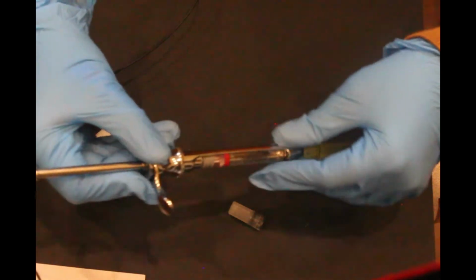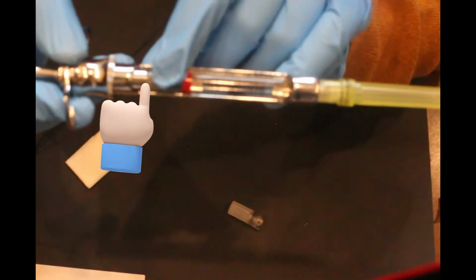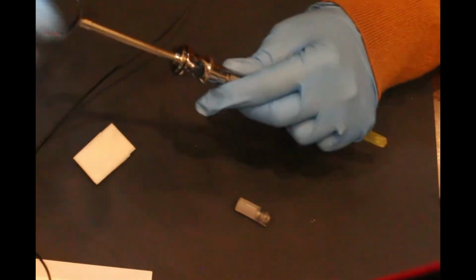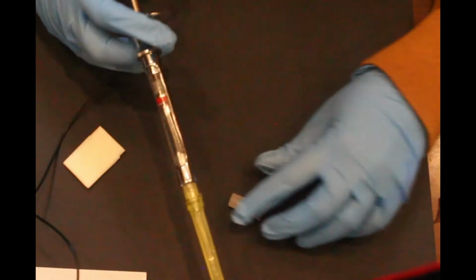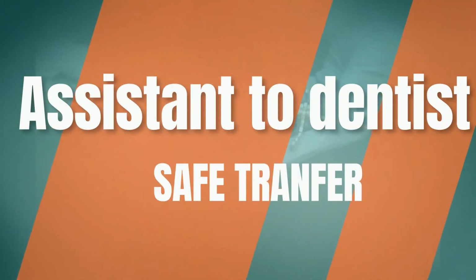At this time, you must see if the rubber part of the anesthetic carpule and the harpoon are attached to each other, and if not, you want to give a little tap on the back because it's very essential to get the proper aspiration. Let's go over how the assistants can transfer the loaded syringe to the operator safely.